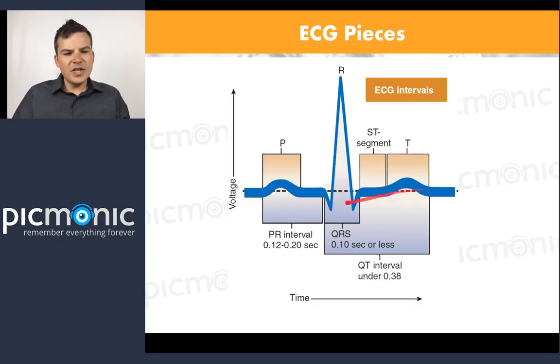So I'm not going to go too much into the intervals themselves, just because I'm running behind. I don't know if it's because I'm talking so much or because the GoToWebinar mess-up is distracting me, but we talked about the P wave itself.